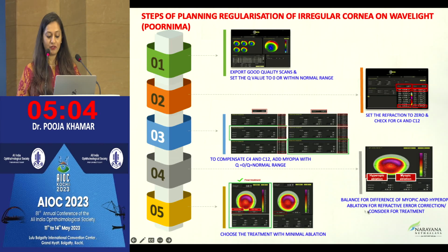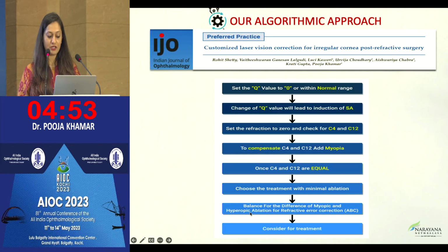And then you balance for the difference of myopic and hyperopic ablation for the refractive error corrections, so to consider for the treatment, and choose the treatment with minimal ablation. So this is what probably you would do for regularization of surface.